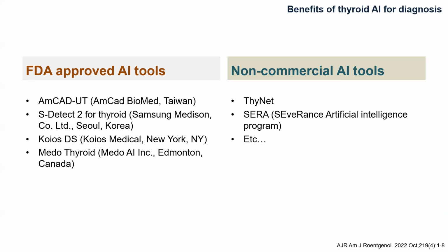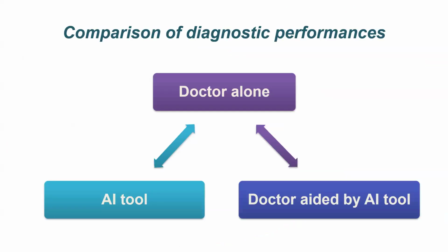There are several AI tools for evaluation of thyroid nodules on ultrasound. The two commercial AI tools listed above were the most often used and studied. AI tools' diagnostic performance may be separated into two categories: comparisons with doctors alone and comparisons with doctors with AI support.